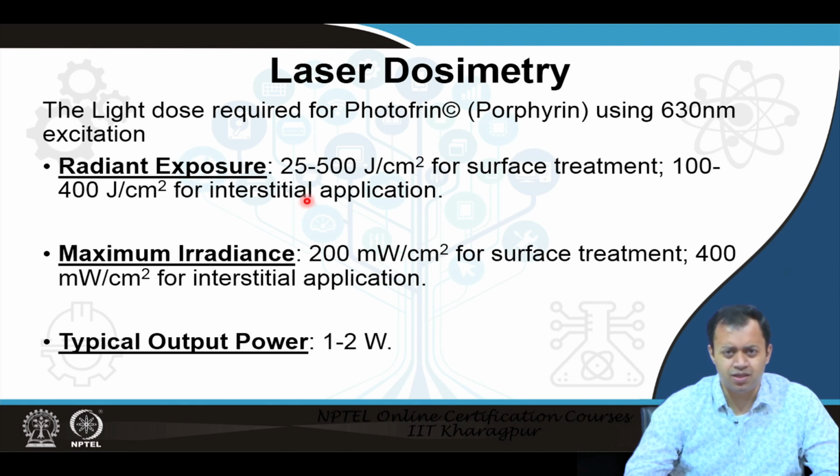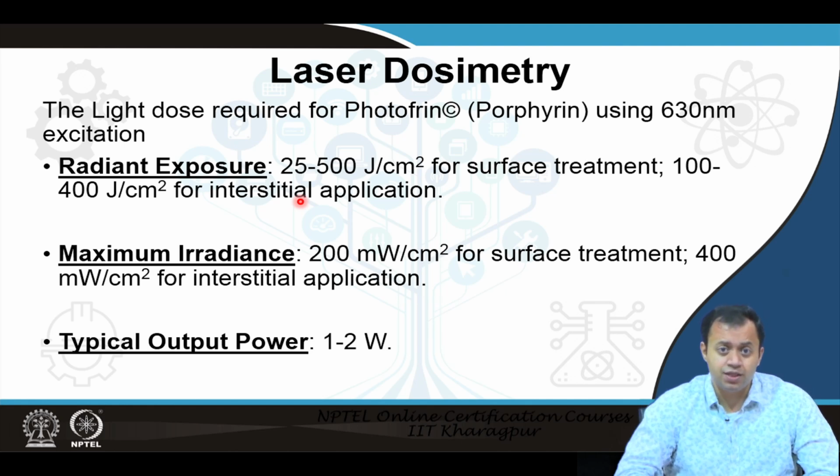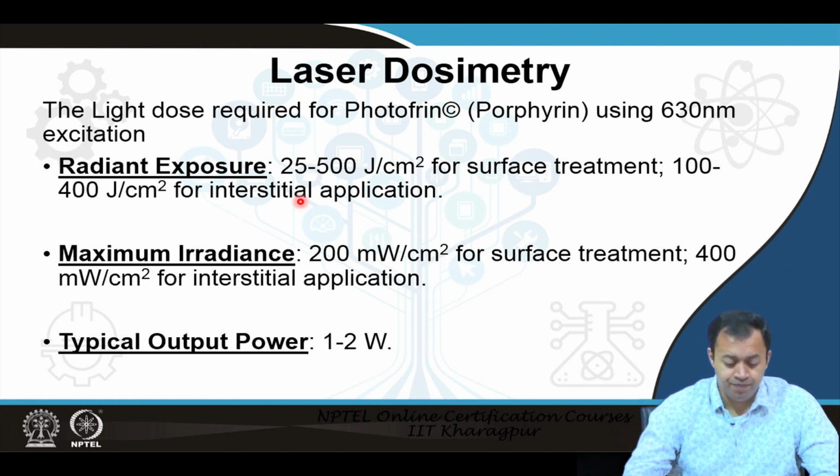I think it is self-evident, right, why the energy per centimeter square is less when it is surface treatment, but more when it is interstitial application. If it is not clear, then I ask you to discuss this and come up with an answer. I will not be giving you all the answers, and this is pretty straightforward: why you require more energy when you are sending light inside a human body.